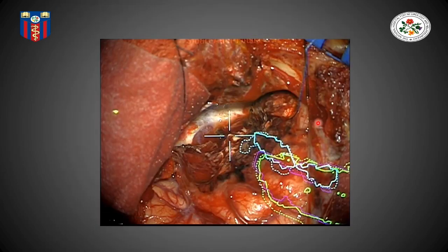And this is the example of projecting your tractography within your operating field. Here you can see a model of the ventricle, and this is a model of the optic radiation. And you can see that in this case we have achieved a resection of the temporal pole, and we have been able to spare nicely the optic radiation, therefore reducing the risk of visual field defect.